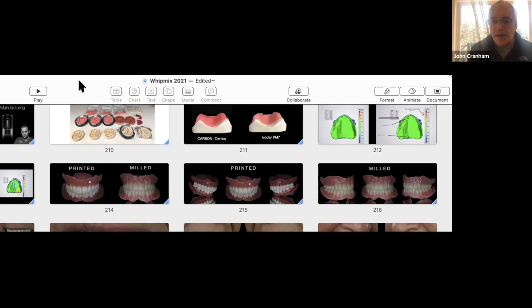All right, Kylie, expert designer. What happens if a denture tooth chips? A patient drops the denture and the tooth fractures. How is the denture tooth repaired? Good question. If you've got the piece of denture tooth, you can just bond it back on with a light cured resin. Anytime we're using light cured resins to bond two pieces of PMMA together, so let's assume the patient dropped it and a chunk of the central is off, you bring it back in, lightly abrade both sides, Connect on both sides, a little light cured resin, whatever's in your office, bond it together and polish it back up.